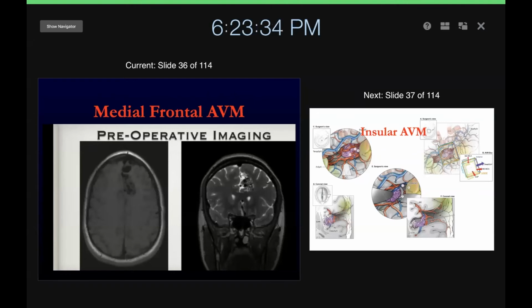And it really helps me see into that plane, into that border. And this is a much more favorable way to see into that dark space. And you can see I'm going around the front of it. Now I'm going over the top of it.